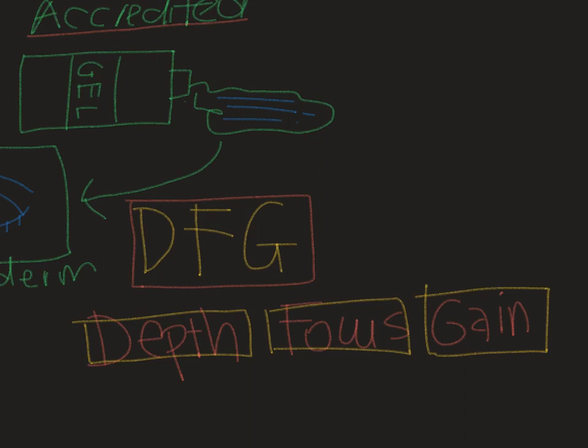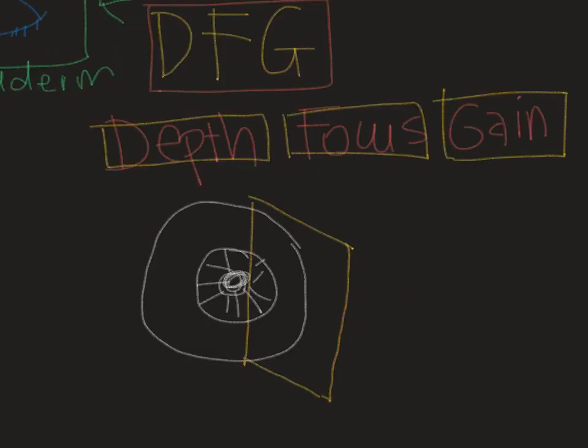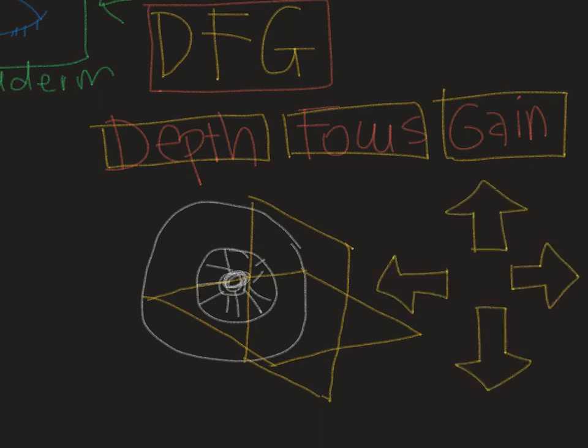Then you scan both eyes in 2 planes, both sagittal and transverse plane, through the closed eyelids. And then you ask the patient to look straight ahead with eyes closed. And don't clench the eyelids. While doing the scanning, ask the patient to look up, down, left and right.